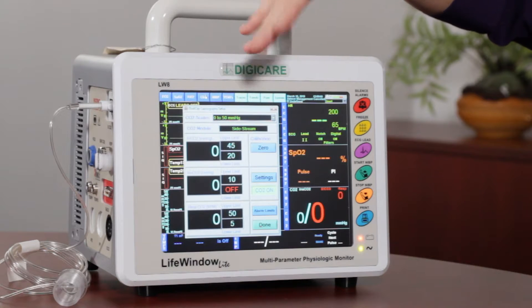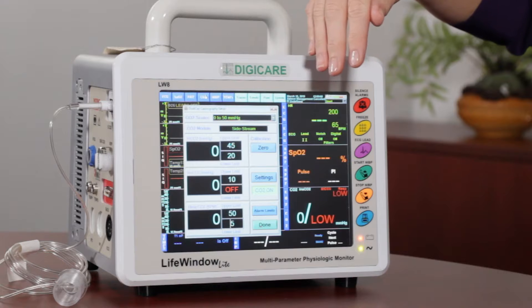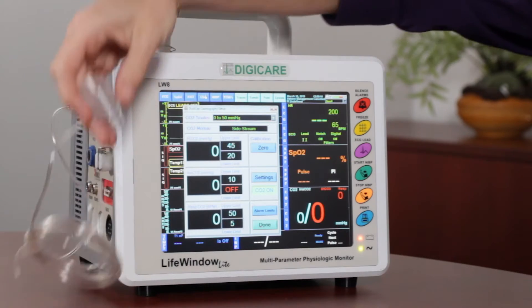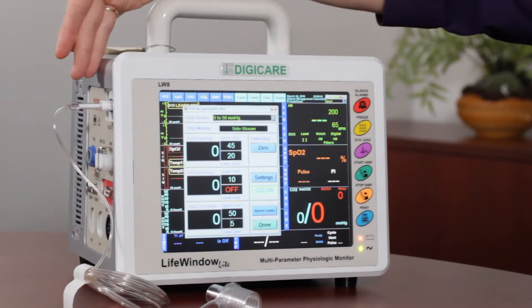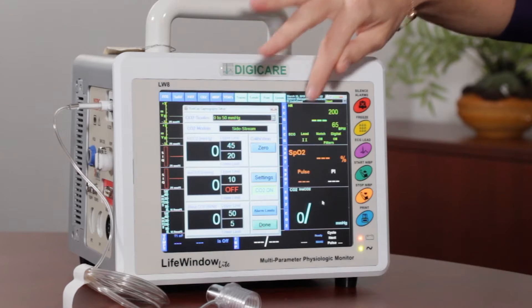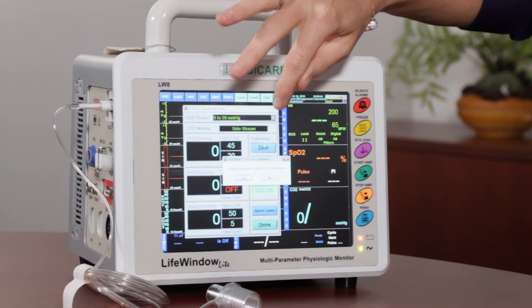Now when you run a zero calibration, either side stream or mainstream, you always want to make sure that the sample line or the airway adapter is off the patient and in a well ventilated area. So this example is side stream — I have it attached to the side of the monitor. We're going to go ahead and run a zero calibration, so all you need to do is hit the zero button.